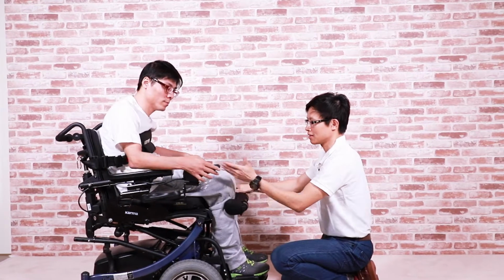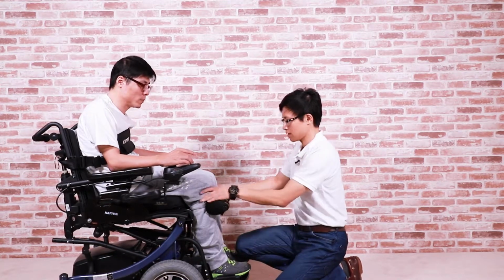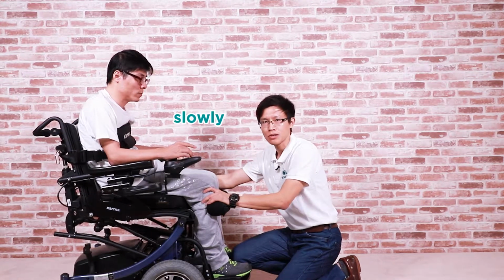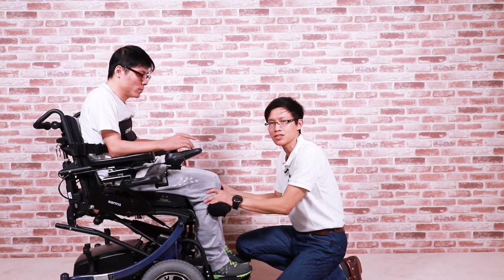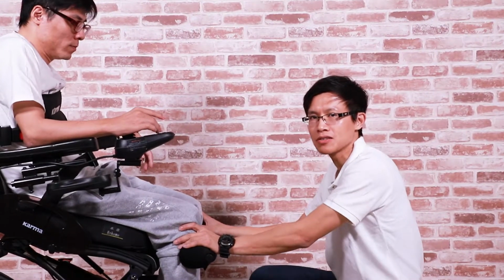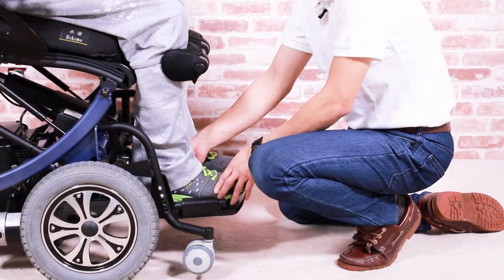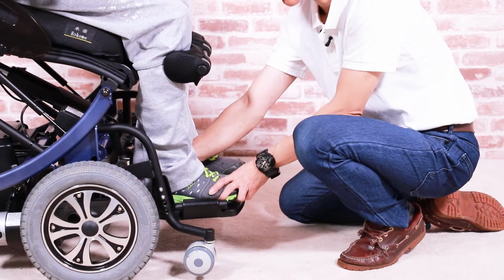Finally, let the user control the controller while standing up, because he knows best about his body. When he is uncomfortable, he can stop or slow down the process right away. Remember to ask the user to stand up as slowly as possible, since a rapid change of body position might trigger contracture or tension. If his legs are misplaced during the stand, we can help him to position his legs again.